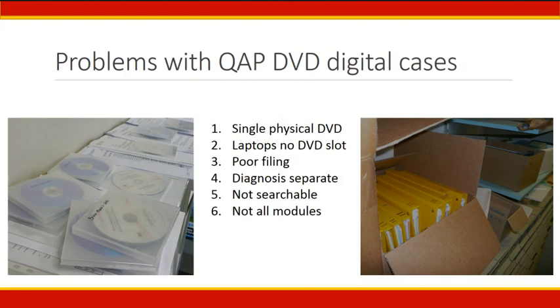Say I'm a registrar who wants to study skin this week. First, I have to find the single physical dermatology module copy in my lab. My experience is the DVDs are often haphazardly filed. Here in Auckland, the current year is stored on top of a bookcase in the hallway, precariously stacked. I'm not sure where the previous year's dermatology modules are. In Sydney, we kept them in boxes in this dark storeroom due to space limitations. Often, the diagnosis sheet is not filed with the physical DVD.